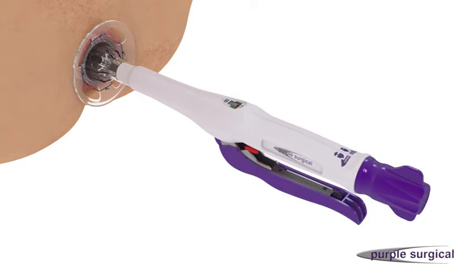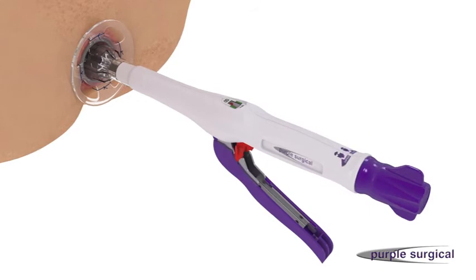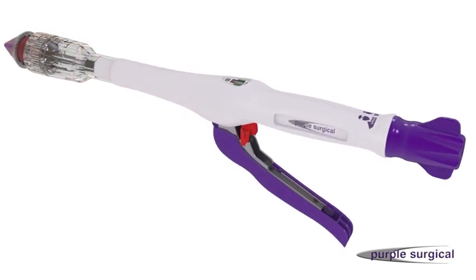After firing, release the firing handle and allow it to return to its original position and return the safety lever to the locked position. Open the device by one half to three quarters of a turn and remove the device from the anal canal. Examine the staple line before removing the clear anal dilator.